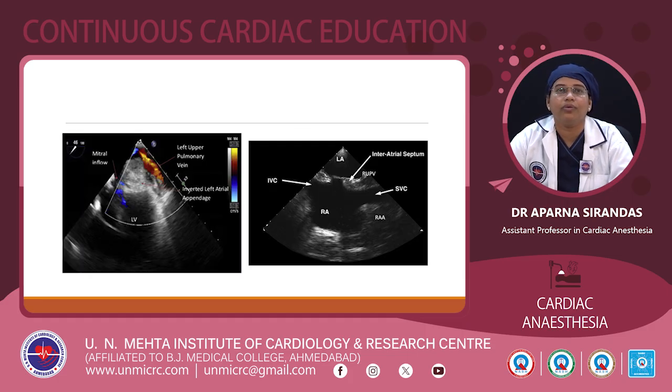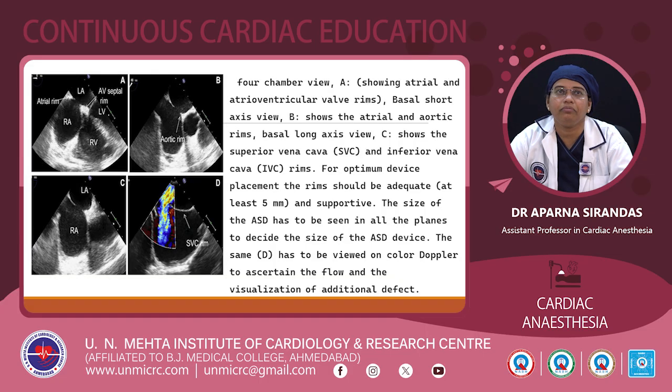And here you are also able to see the left upper pulmonary vein, and this is the B figure, the right upper pulmonary vein, and this is the 4-chambered view showing atrial and atrioventricular valve rims.